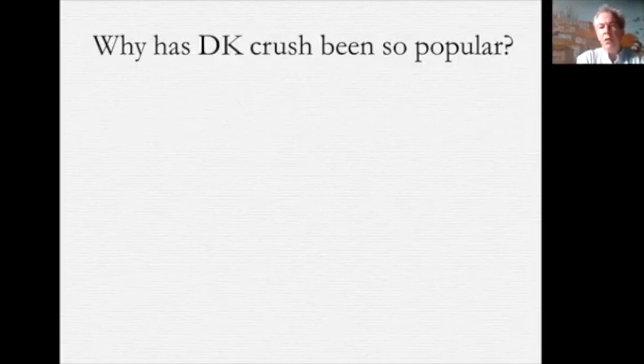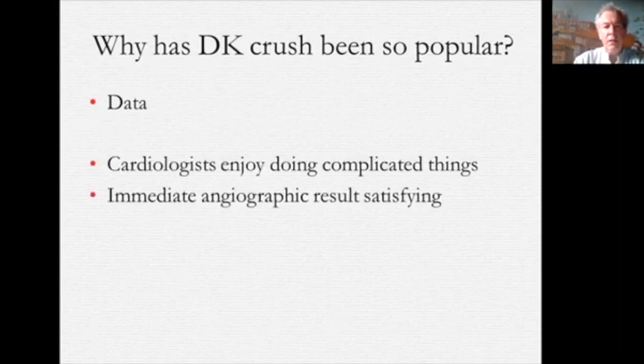So I have to ask why DK crush has been so popular. And there are two reasons. One is the data, and the second is the aesthetics. If you like, cardiologists do, I think, enjoy doing complicated things and can be beguiled by the immediate angiographic result. It's a relatively complex procedure, so at the end of a good DK crush, the cardiologist feels good about themselves, and they feel good because there's a lovely angiographic result, not taking into account the fact that where there are two stents when there might have been one, of course, there is the additional risk or opportunity for restenosis or stent thrombosis.